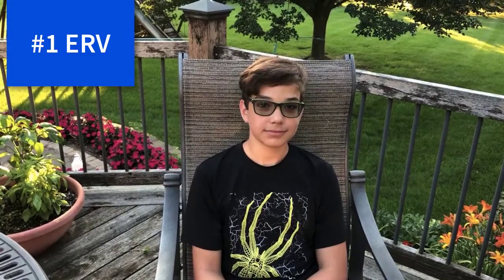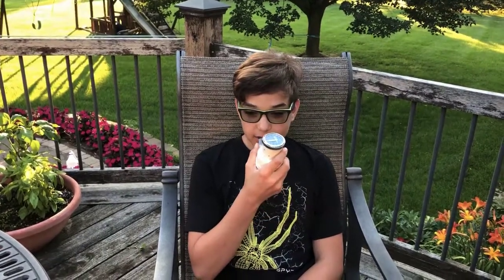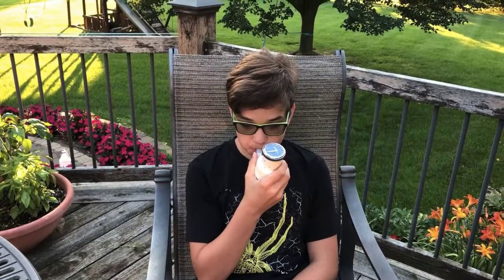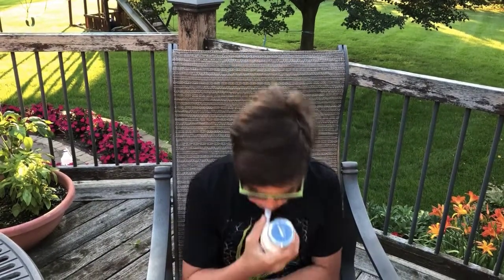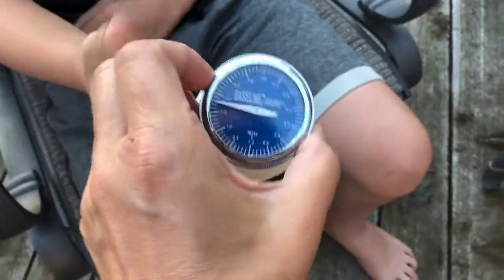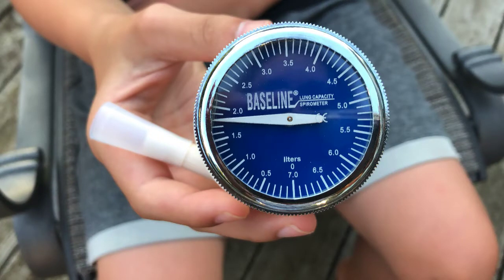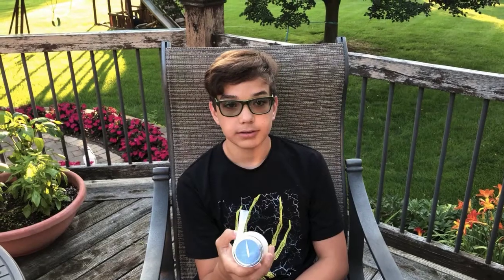So first time, are you ready? Okay. Hard, hard, hard. Bend over, there you go. All right, so turn it so it's zeros at the bottom. So it looks like we got to about 1.8 liters.